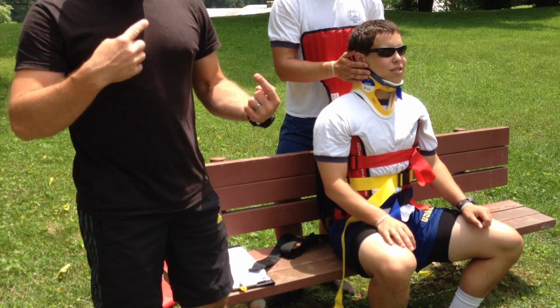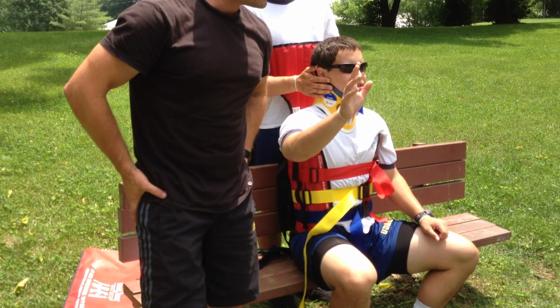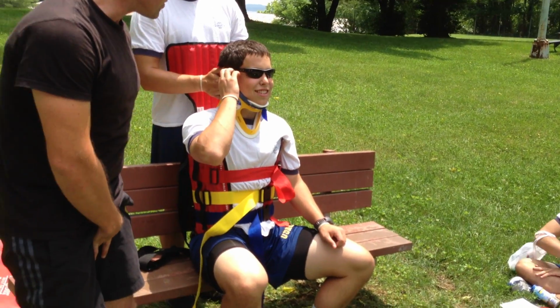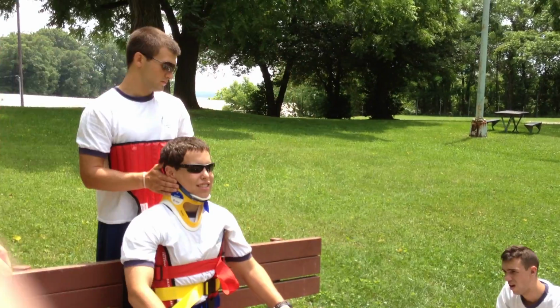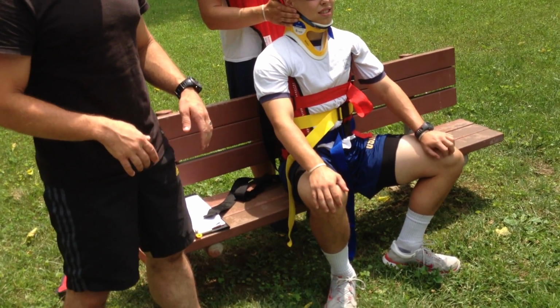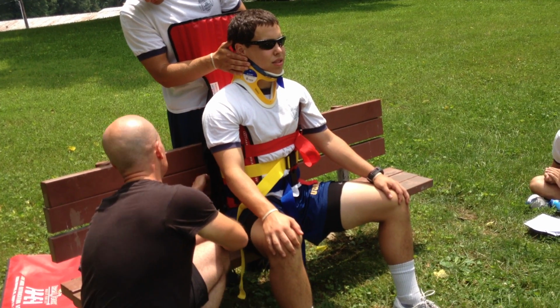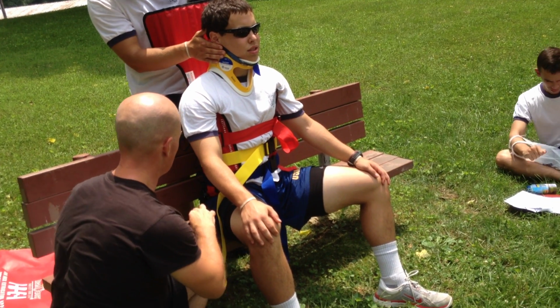All right. Now it's time for those leg straps. Who's climbed in a harness before? Good, good, good. Do the straps go down here around the thigh, or are they uncomfortably close to the family jewels? Yeah, sadly so. And that's exactly what we're shooting for with this device as well. Some folks will go so far as to even cross the straps underneath the groin. We don't recommend crossing the straps, but it is important that you floss the straps. And here's how that ends. I reach back here in my patient's automobile. I find the appropriate strap, and I need to be careful to make sure that it's not twisted in any way.